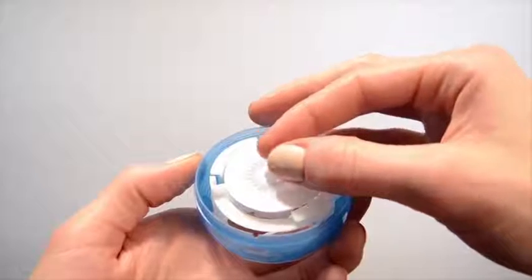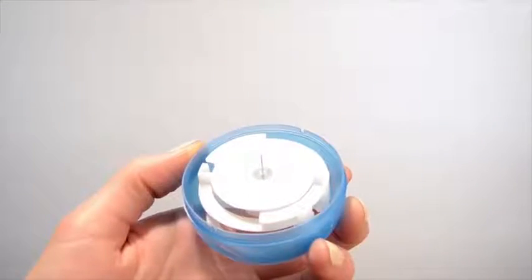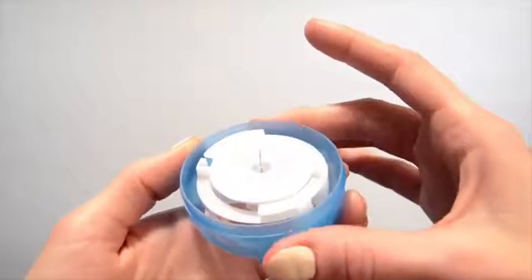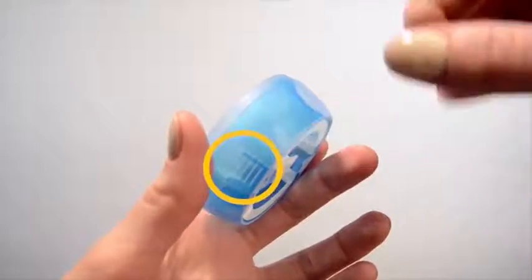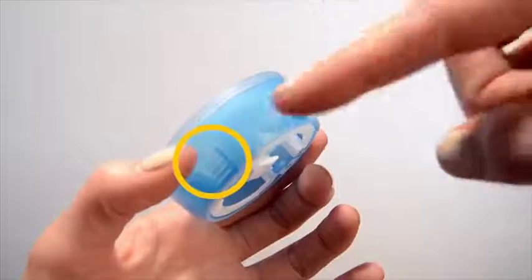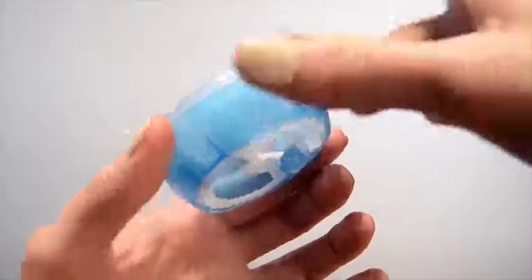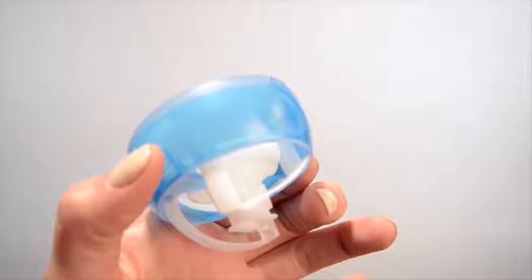Remove the needle guard by gently twisting to loosen it and pulling it off. Turn the insertion device over and with the insertion needle facing away from you, hold the lined ridges located on either side of the device. With the other hand, pull on the center of the insertion device until you hear it click. You are now ready to apply the device.